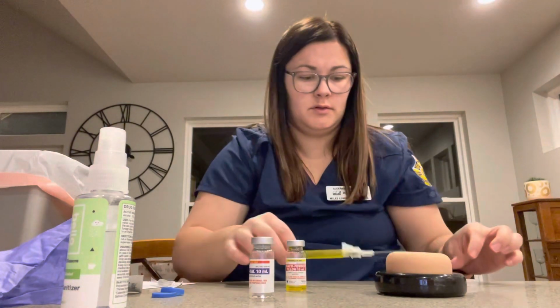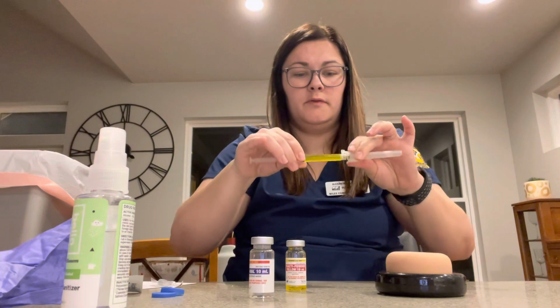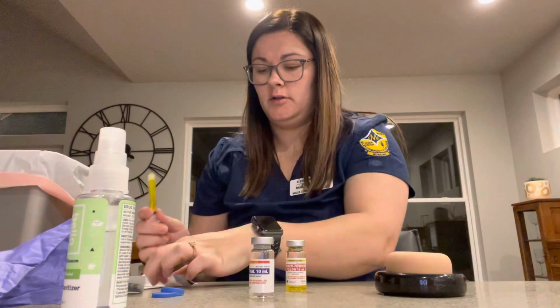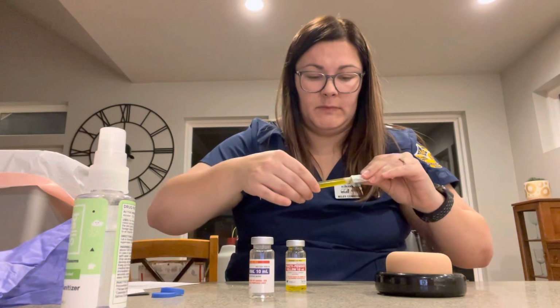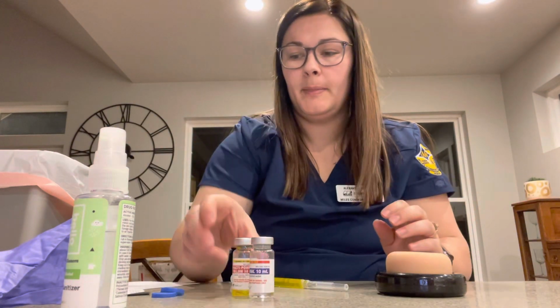Perfect. I will then recap this needle. It is now dull from being punctured so many times. I will discard of that and get a clean needle. Now we are ready to go into our patient room.